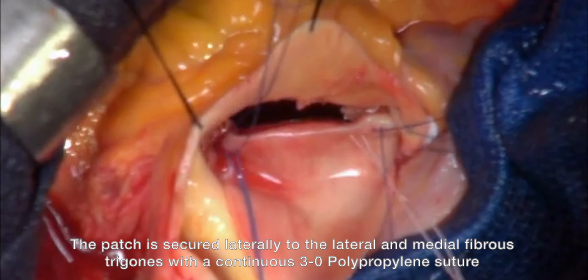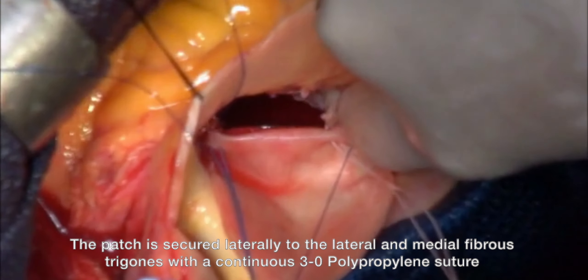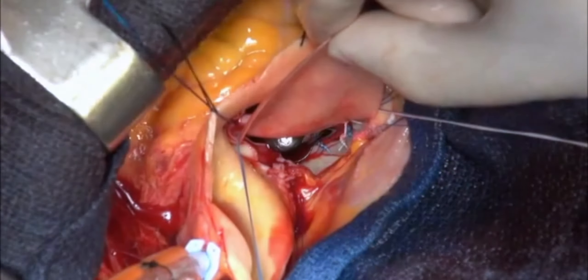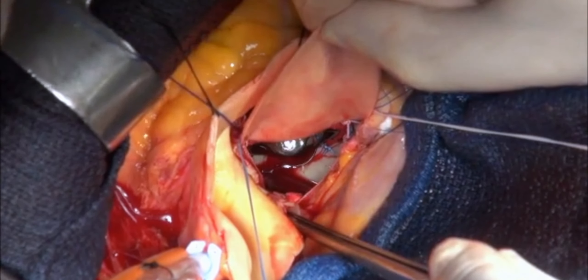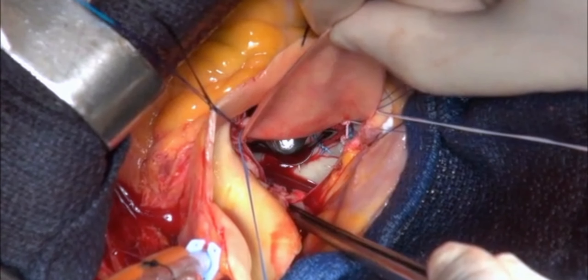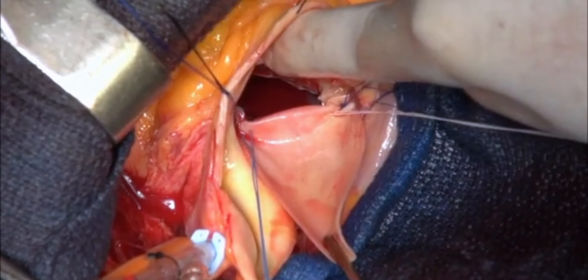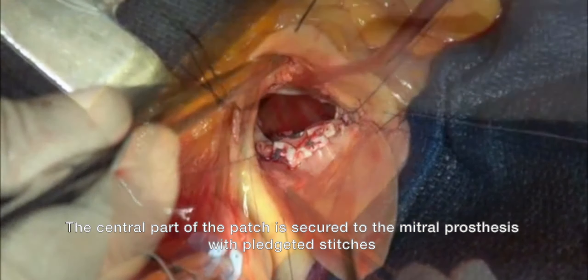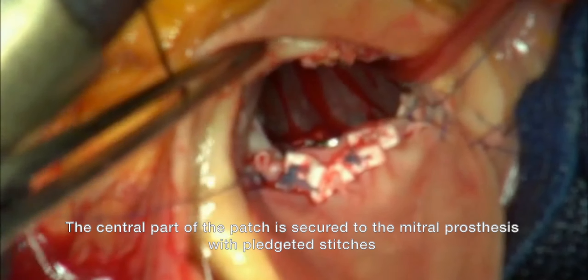We must fix the patch as close as possible to the large mitral sutures to avoid a paravalvular leak. The central part of the patch is then secured to the mitral prosthesis.